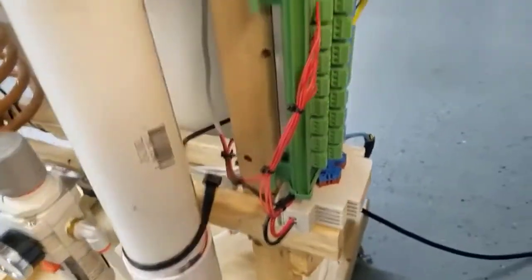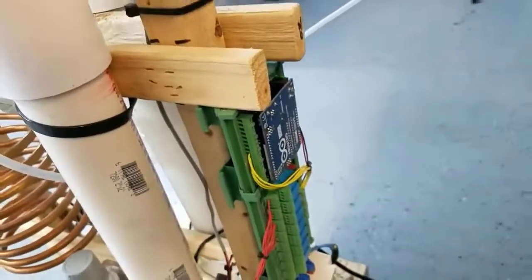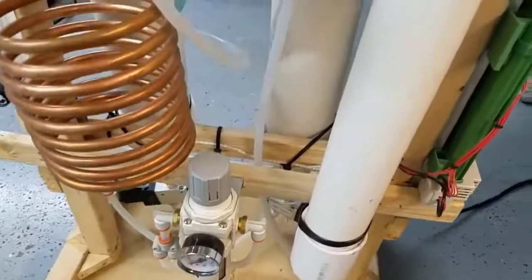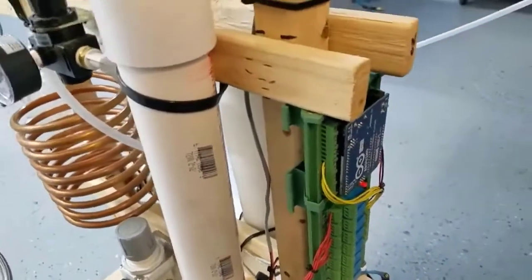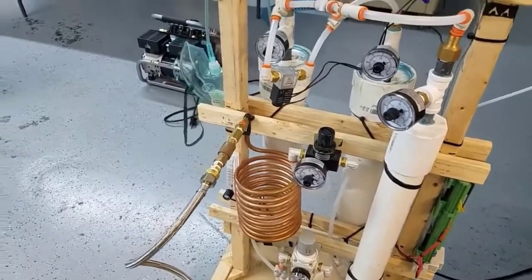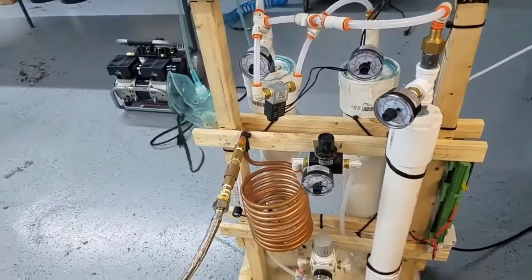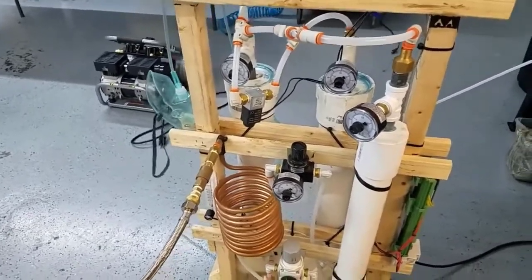One of the relays is used for turning on the compressor, but it's not used right now. So basically we're only using three of them because we have three valves: an equalization valve and two input valves. We are going to make the code available. We're using about a five-second cycle for each active sieve, a 300 millisecond equalization cycle, along with a 300 millisecond fill cycle.